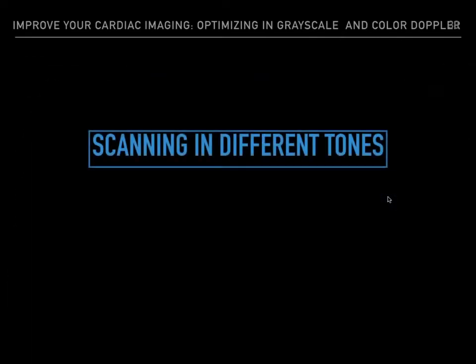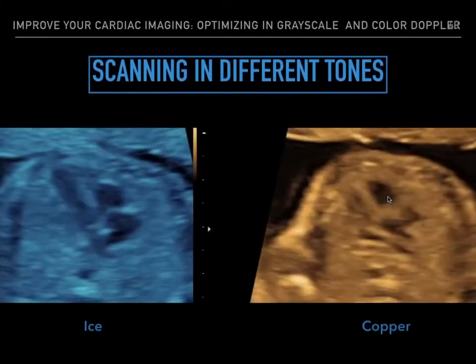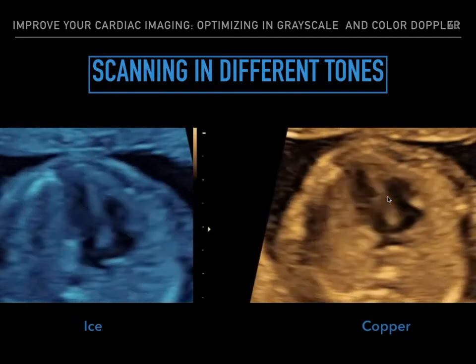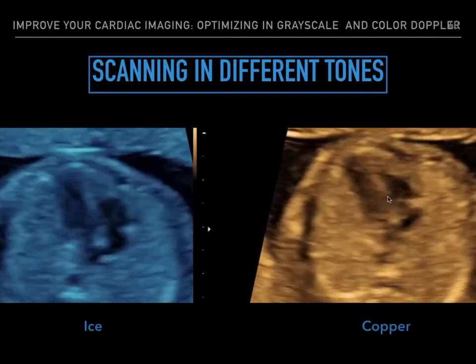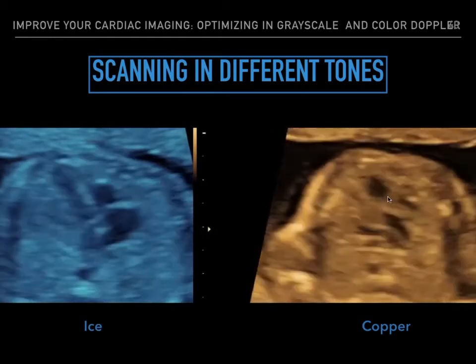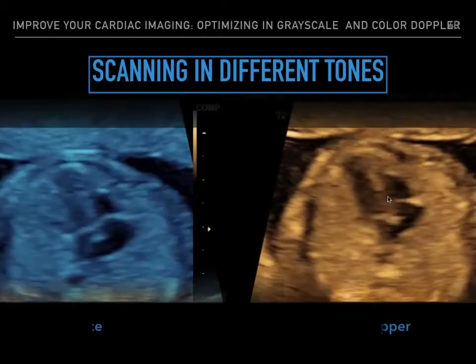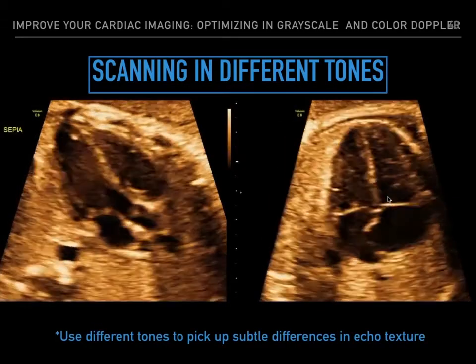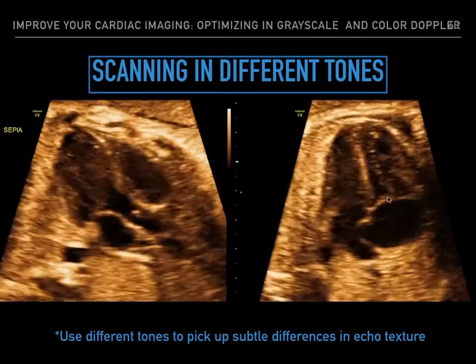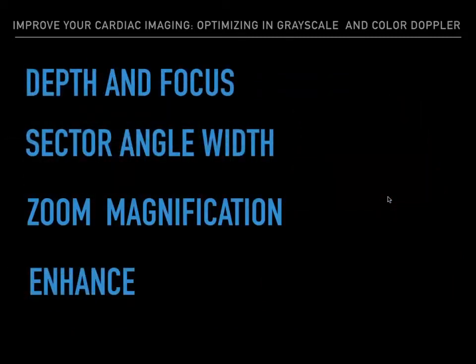Scanning in different tones. Manufacturers have made available more color maps. Perhaps this may actually improve visualization or pattern recognition, as the human eye is able to distinguish image details in color rather than on grayscale. What I've noticed is a lot of cardiologists usually like to look at the heart in sepia to pick up the subtle differences in echo texture that are difficult to see in grayscale. So why don't you go ahead and give it a try and you be the judge.